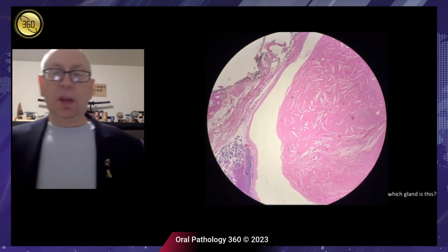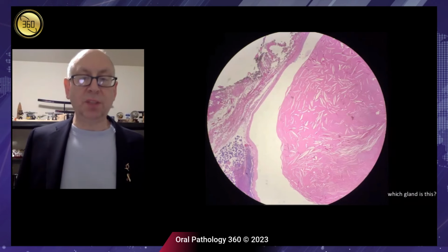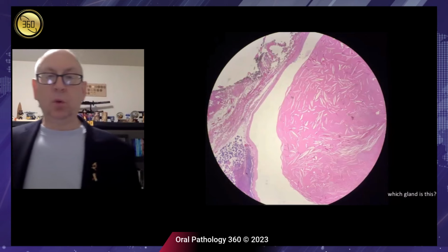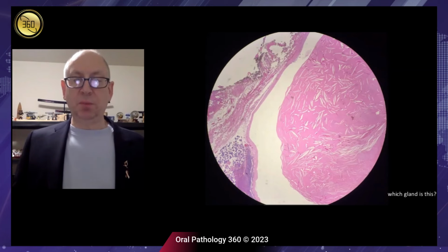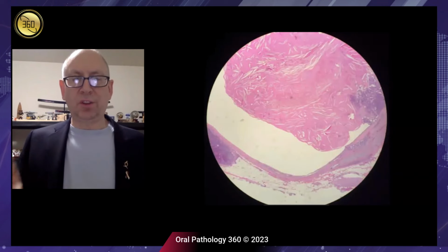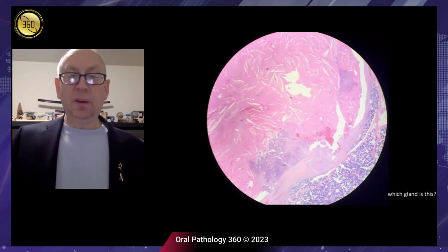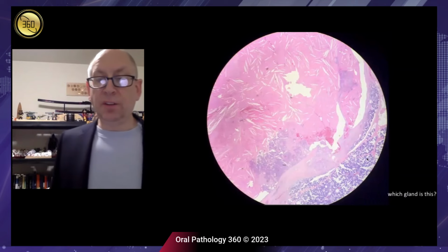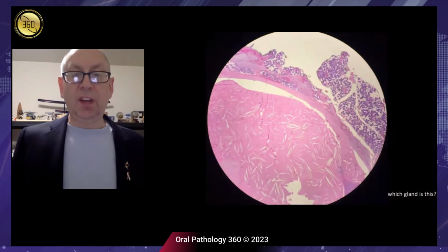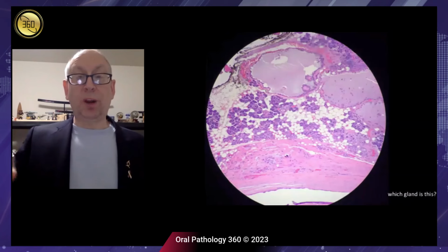So I can always ask the question of my learners, what gland is this? If you look to the left, you'll see there's an admixture of glandular tissue and some fat, and we'll find out that we're in the parotid gland. So this is largely a cystic tumor that has this mucinous, inspissated material in the center with these cholesterol clefts. And I'm just working you around the tumor to see it actually is fairly well contained. We'll see some tumor growing into the lumen of this, and that's going to be our area of interest with our normal gland around the edge. So we'll work our way around to determine, okay, this is a fairly well encapsulated tumor for whatever it is.